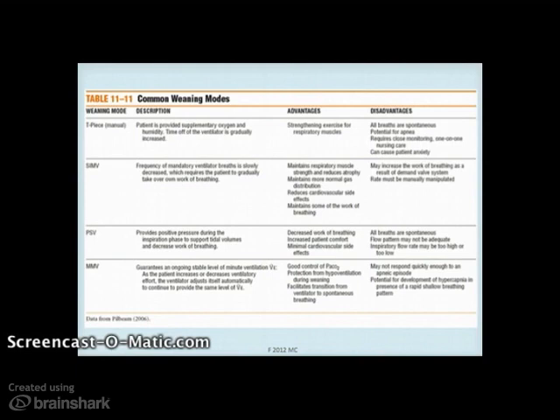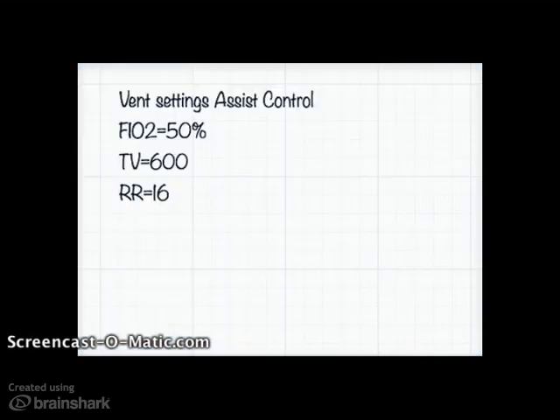This type of ventilator mode maintains respiratory muscle strength, which is what you need in order to wean, and normal gas distribution. It reduces the cardiovascular side effects of controlled or assist-controlled ventilation. However, it increases the work of breathing, and sometimes patients get tired from this.